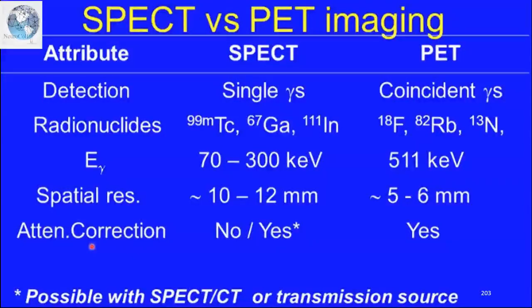So the detection is single detection that's going one way. If you're detecting from here, you're detecting anterior view. If you're detecting behind, it's the posterior view. But it can also do rotational, but it's only detecting one directional rays coming out of the patient. Whereas PET scan is scattered all over, at least bi-directional you're going to detect. The other coincidence, all you will be considered as scatter, right?